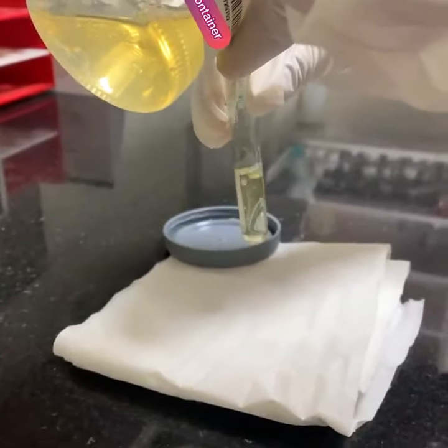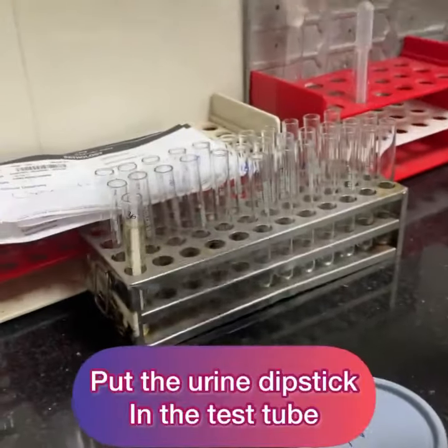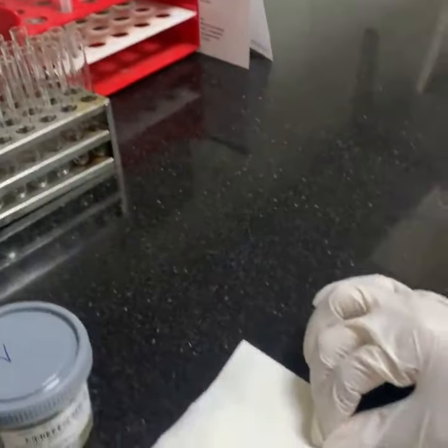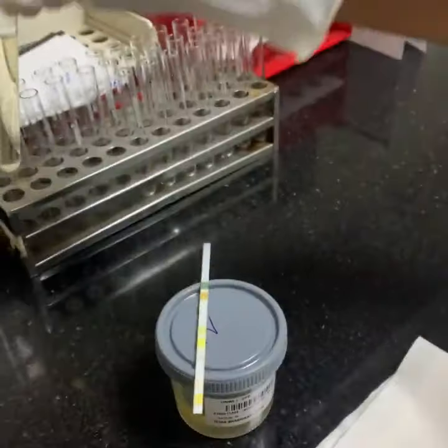Take the urine strip and put it in the test tube. Let it be there for 30 seconds. Now take the strip out, remove the excess, and then keep it on the bottle of the urine.